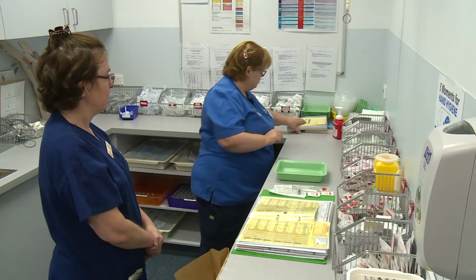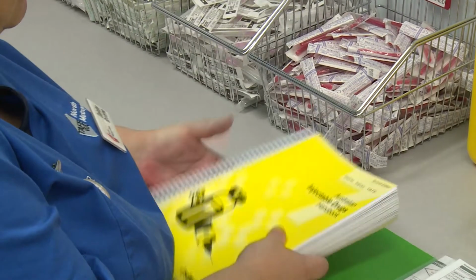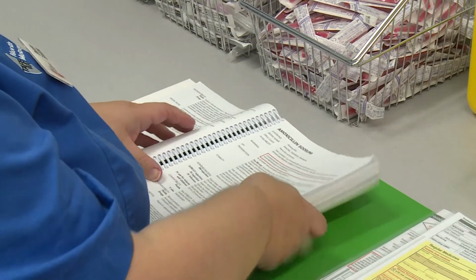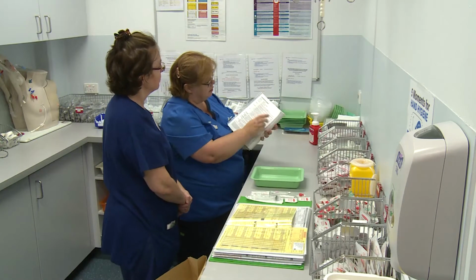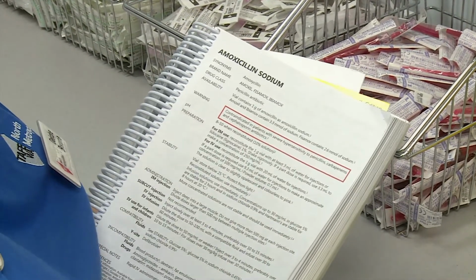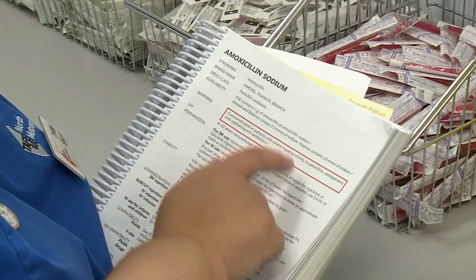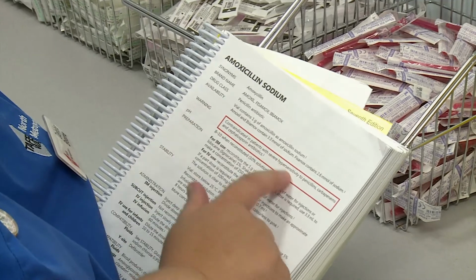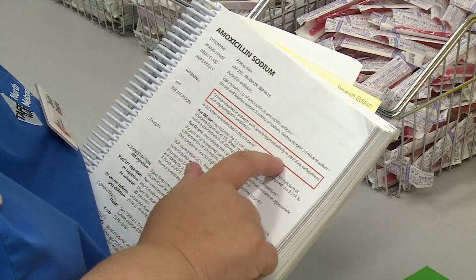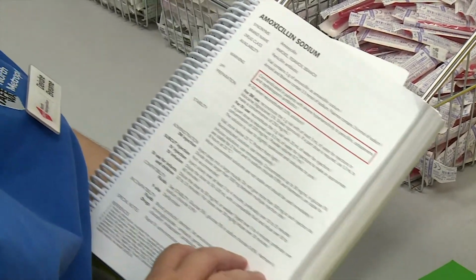And the reason I know it's a 20 ml syringe is that if you look in the Australian Injectable Handbook, you'll see amoxicillin sodium, so preparation, we're going to reconstitute for IV, because it says IV here, reconstitute 1 gram vial with 20 ml of water for injection. There is a warning in relation to people with hypersensitivity to penicillins, carbapenems and cephalosporin antibiotics, but thankfully Thomas isn't allergic to anything, so we don't need to worry.